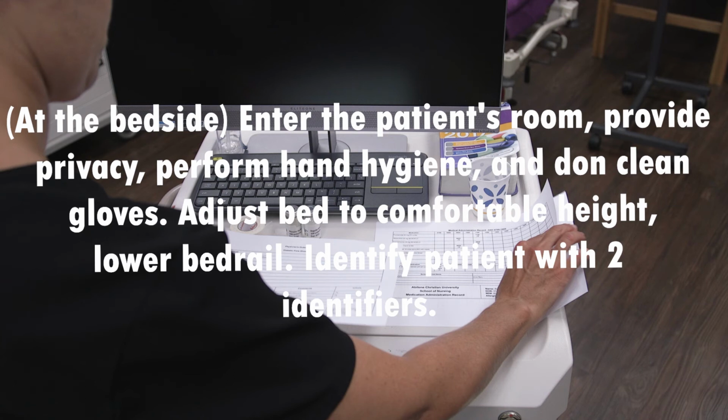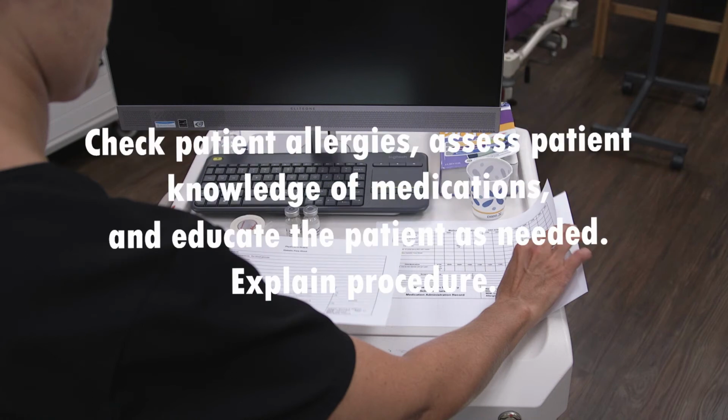Bedside. Enter the patient's room, provide privacy, perform hand hygiene, and don clean gloves. Adjust bed to comfortable height. Lower bed rail. Identify patient with 2 identifiers. Check patient allergies, assess patient knowledge of medications, and educate the patient as needed. Explain procedure.